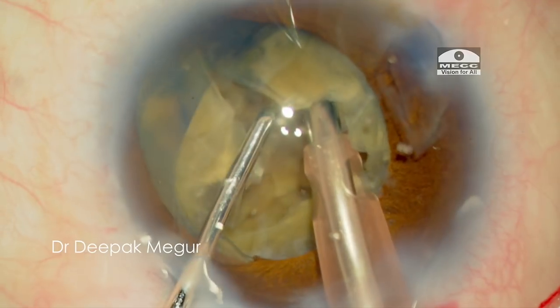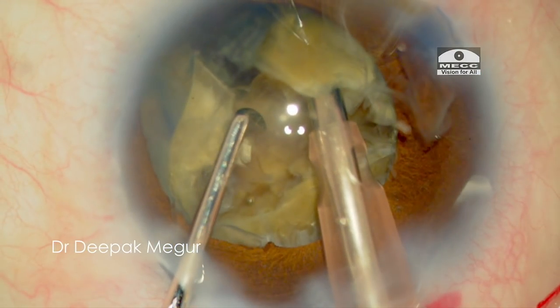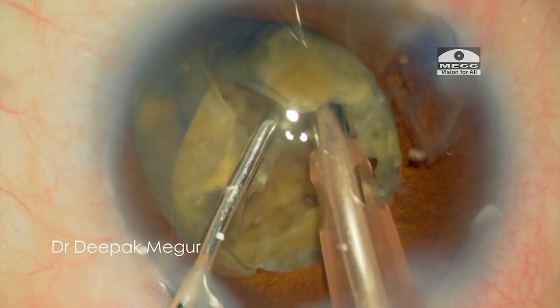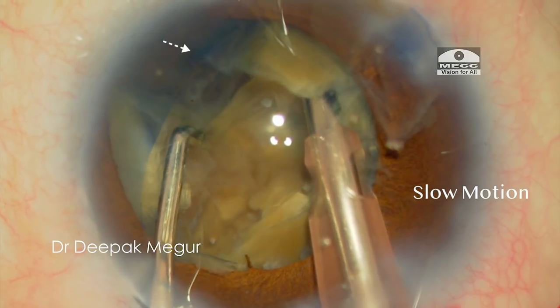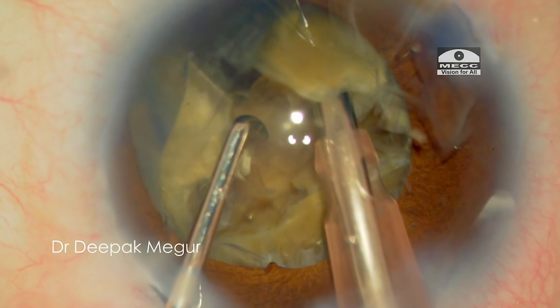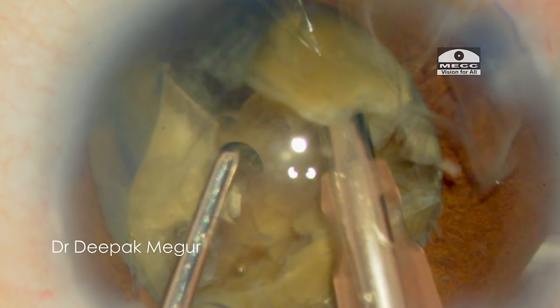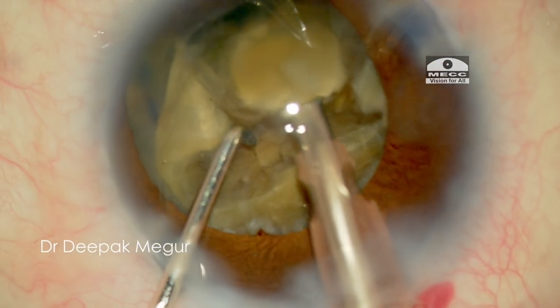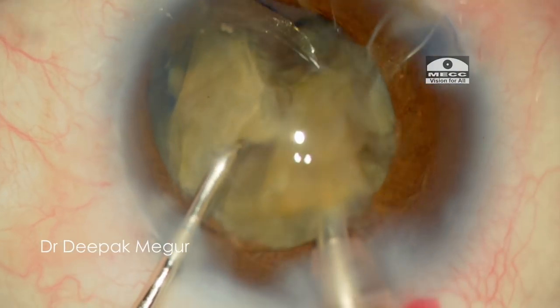But during this maneuver, I could feel something unusual has happened — I felt something snap. Let us check out what happened. As I am trying to laterally separate the posterior plate of the fragment, the rhexis has snapped at the 6 o'clock quadrant. This is really an uncomfortable situation to be in: a large hard nucleus with very little space to maneuver, and now, to top it all, I have a torn rhexis.